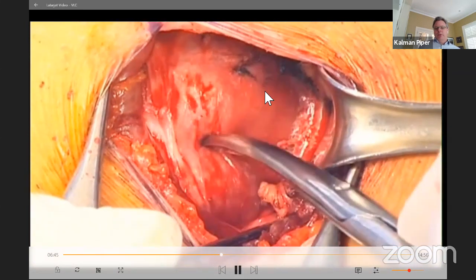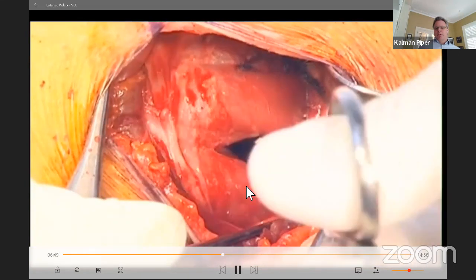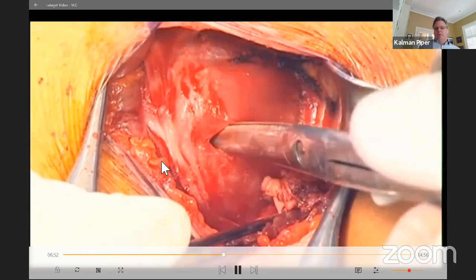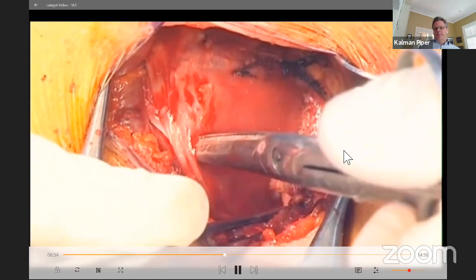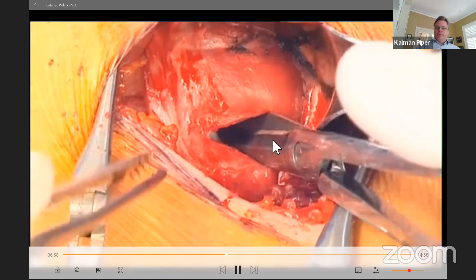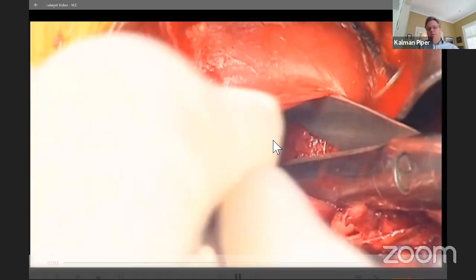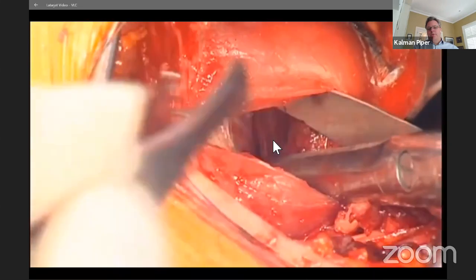And the split is between, it actually has 3 raphae. The split is between the middle and the distal thirds, or the lower thirds of the subscapularis. A horizontal split in the muscle using blunt dissection, but don't go through the capsule. So a horizontal split in the muscle, but a vertical capsulotomy.